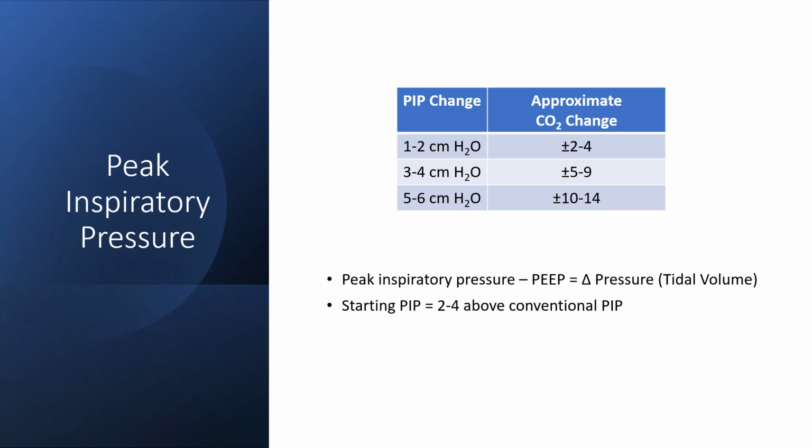The jet ventilator administers breaths at a volume that is below anatomical dead space. However, the high frequency of breaths and Taylor dispersion forces allow for a high amount of dead space to be cleared from the lungs. When this occurs in the presence of optimal mean airway pressure and maximal ventilation perfusion matching, there is a significant elimination of carbon dioxide.